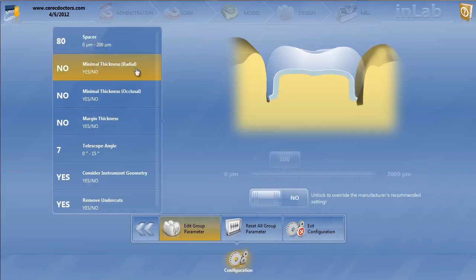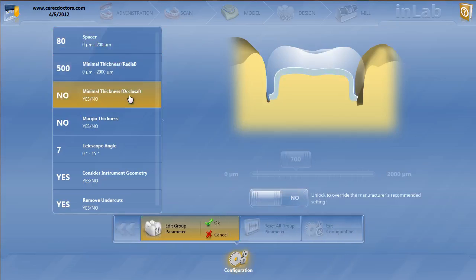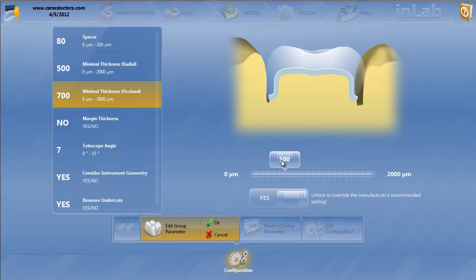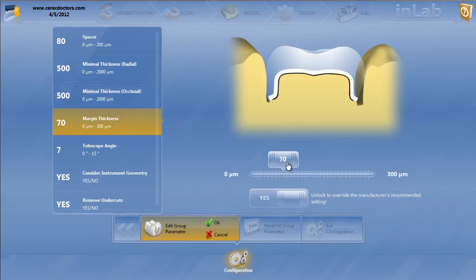Minimal thickness, these are very important. You want these very low. At 500, minimal thickness radial, again 500. Margin thickness, we want to keep this somewhere in the 70 range, 70-80 range.